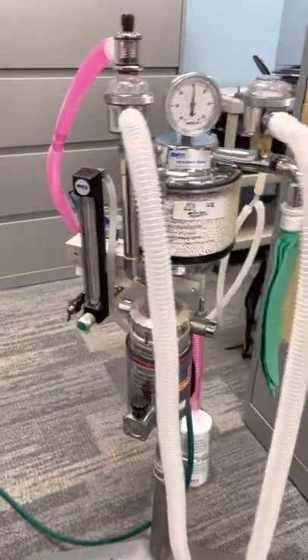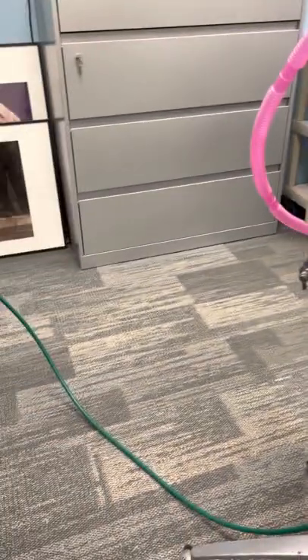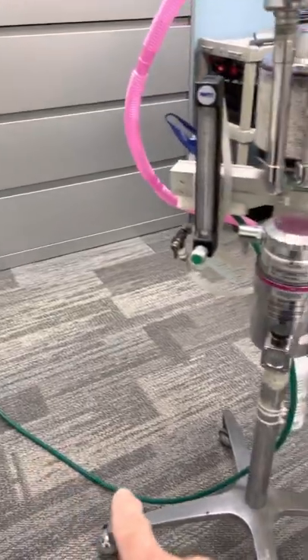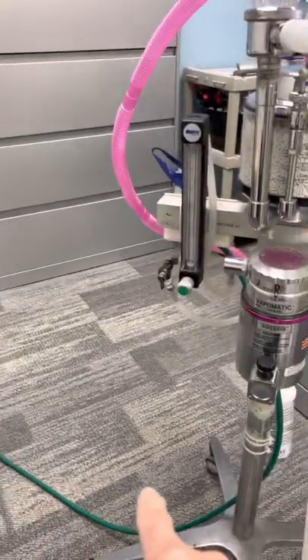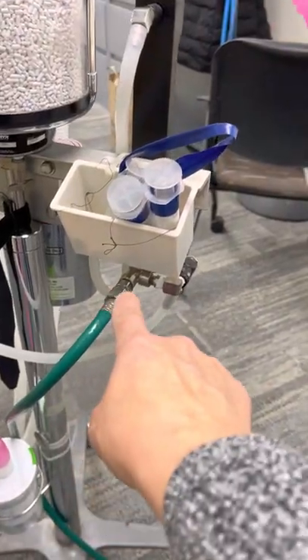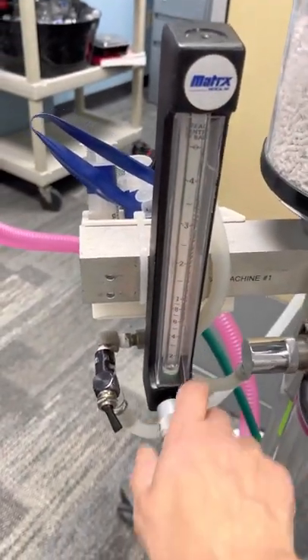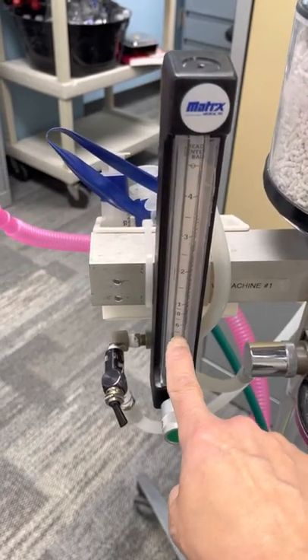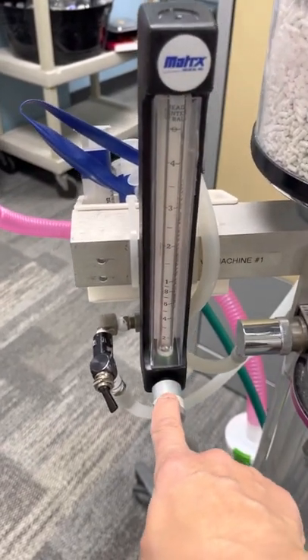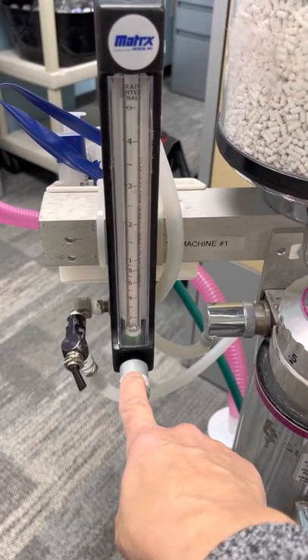Okay, so how does gas flow through this machine and make it a rebreathing circuit? We have our oxygen that comes through from our oxygen source, comes through this green tubing here. And if we follow that tubing in the back of the machine, you're gonna see the green tubing comes into our flow meter. This is our flow meter here. So the oxygen comes in. And we're going to turn that on. I don't have it connected to oxygen right now, but you would read the center of the ball, and that reads liters per minute. That's how many liters of oxygen that animal is going to receive per minute.